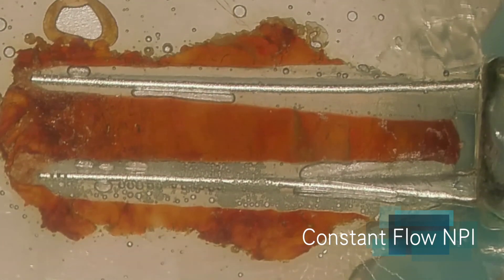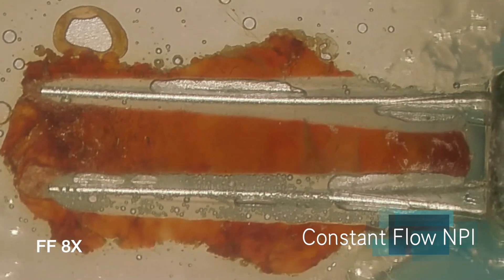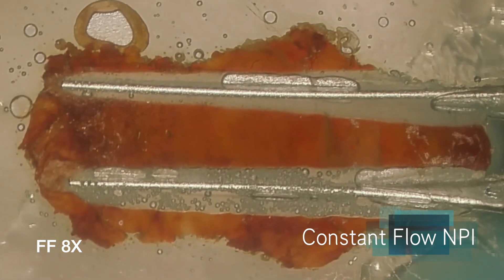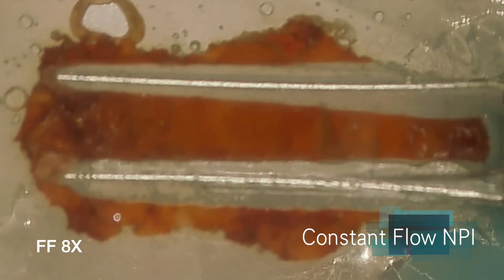So let's watch in speeded-up mode. At 8x, we can see it's a little jumpy. The fluids are being exchanged. They're being suctioned down to the end of the canal.